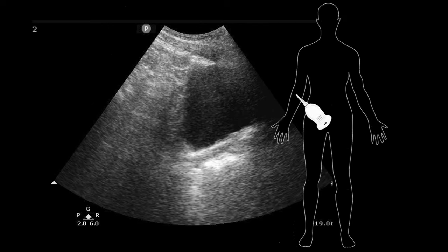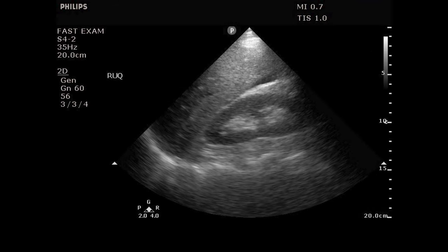Moving down to the pelvis, I like doing the pelvic view in sagittal orientation because it gives a view of the intraperitoneal space on the left side of the image and the bladder in the pelvic space on the right. Scanning from iliac crest to iliac crest gives a nice sweep of the pelvic area. The fluid will collect just cephalad to the bladder on the left side of that image. Those three prior images were normal — what a negative FAST exam looks like.